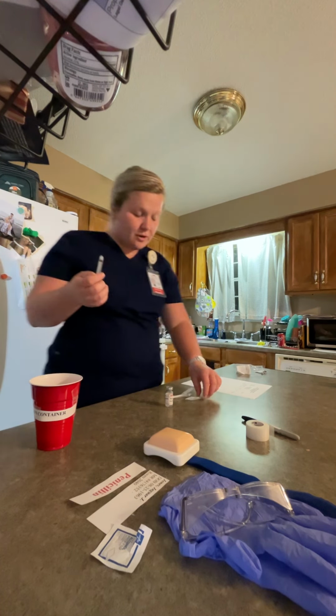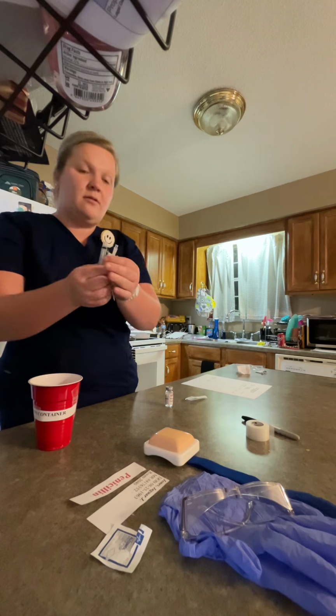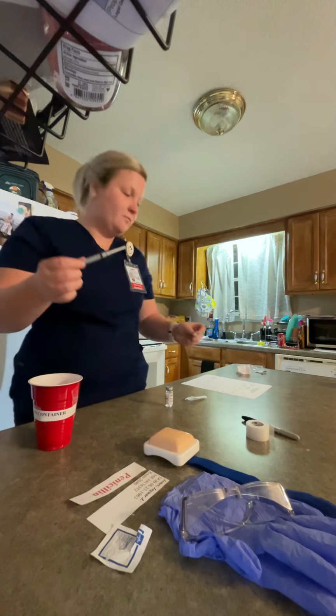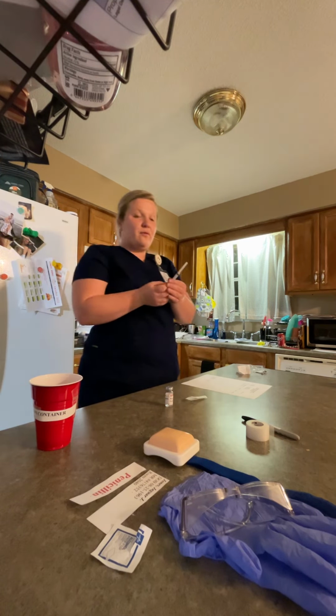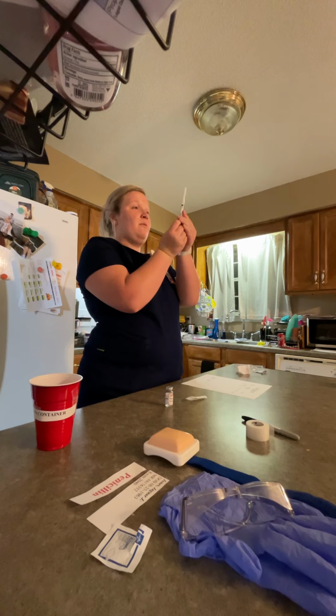And I'm going to start with my blunt tip cannula, and I'm going to screw it on there. Now, before drawing up the medication, I'm going to draw back 0.5 milliliters of air.